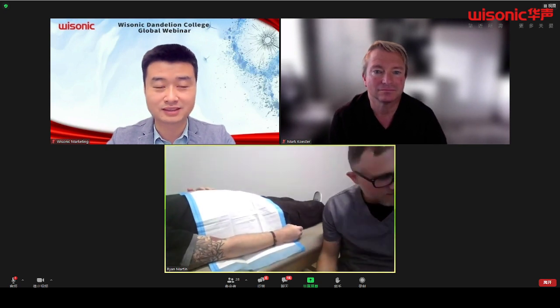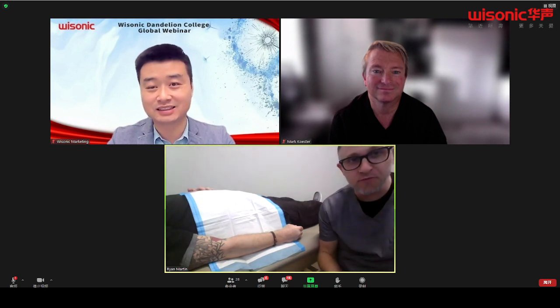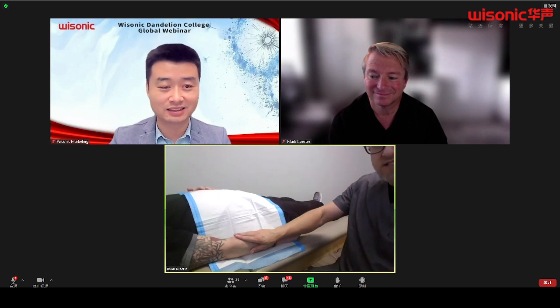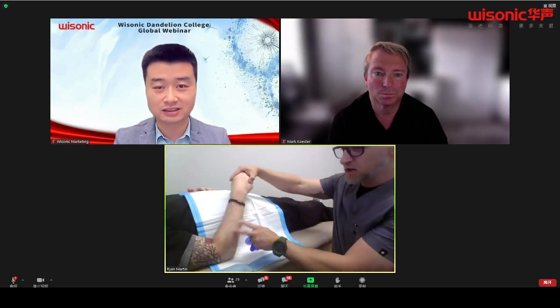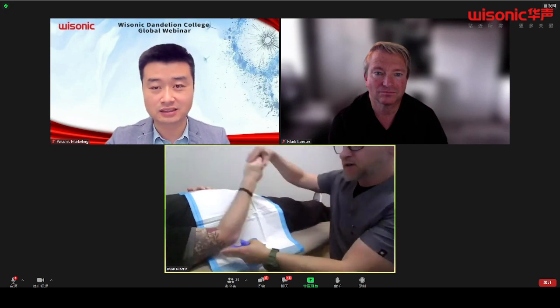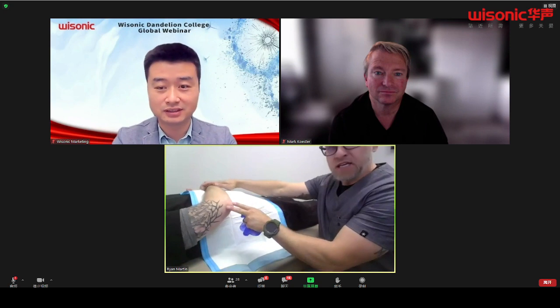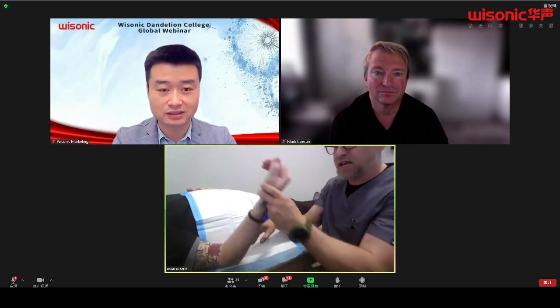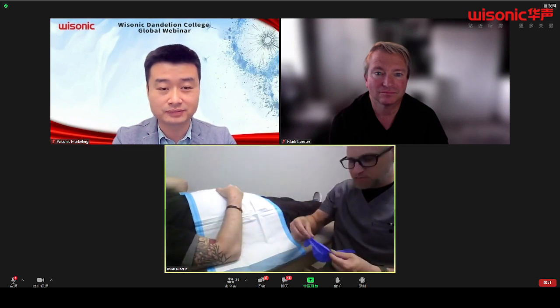All right, everybody, I'm back. Hopefully everybody else is back and stuck around with us. So this view here, I have my camera so you can see Tim's arm here. Most of the views that we're going to be looking at are going to be on the lateral, anterior, and posterior aspect. Once we look at the medial aspect, I'll have Tim roll on his side, and we'll look on that medial side here. So we're going to start our scans on that anterior window as we talked about before.